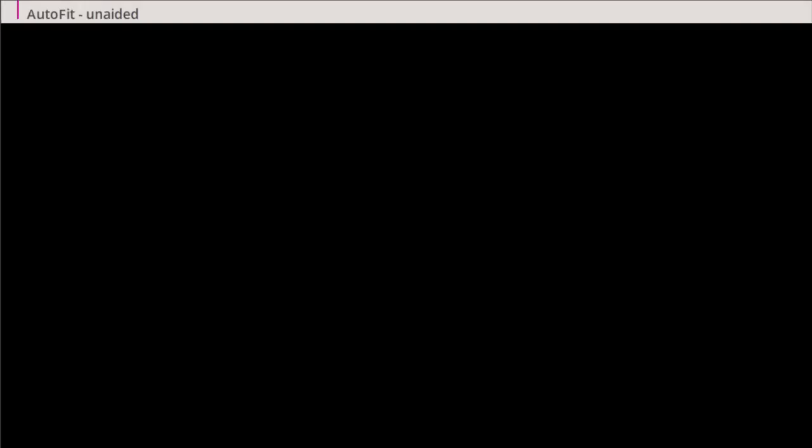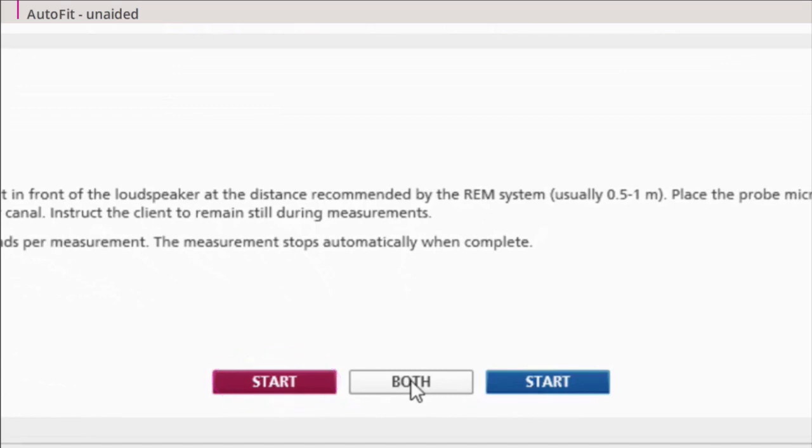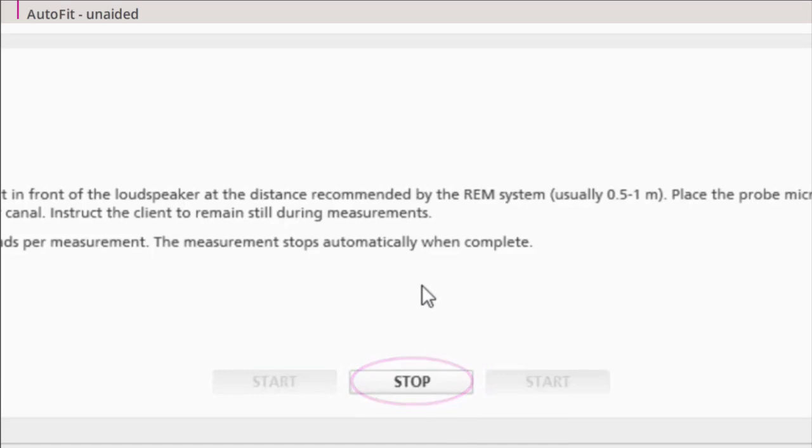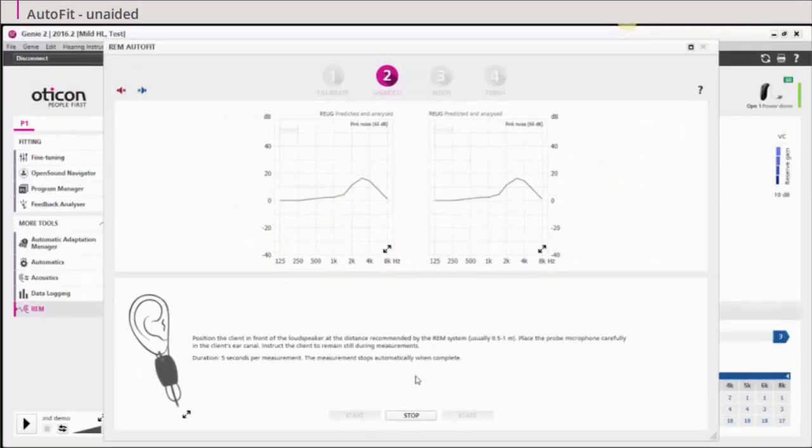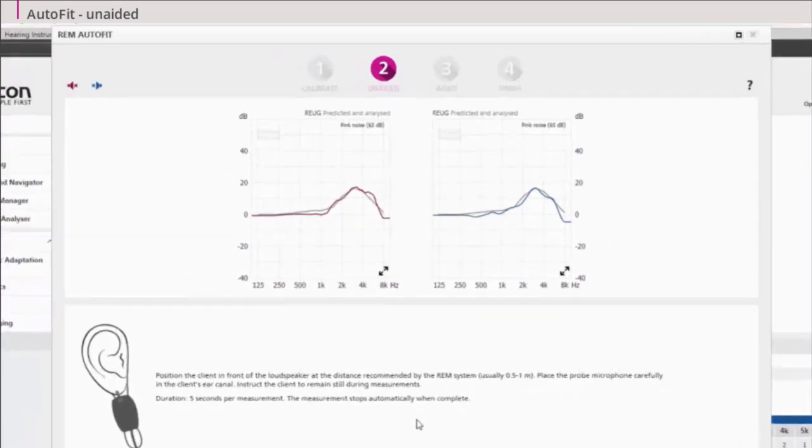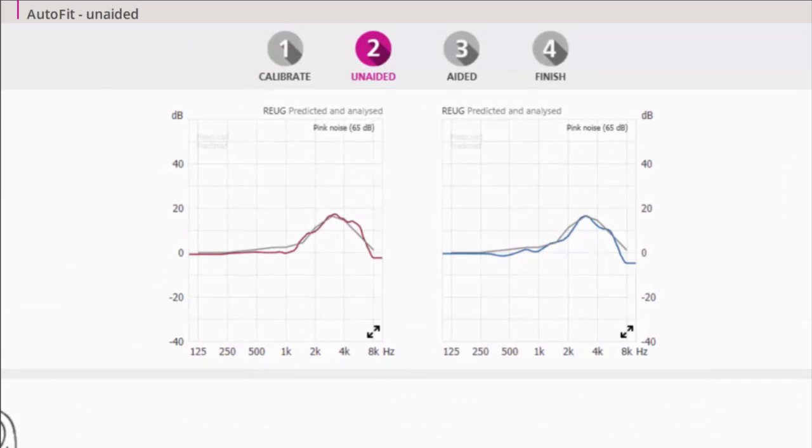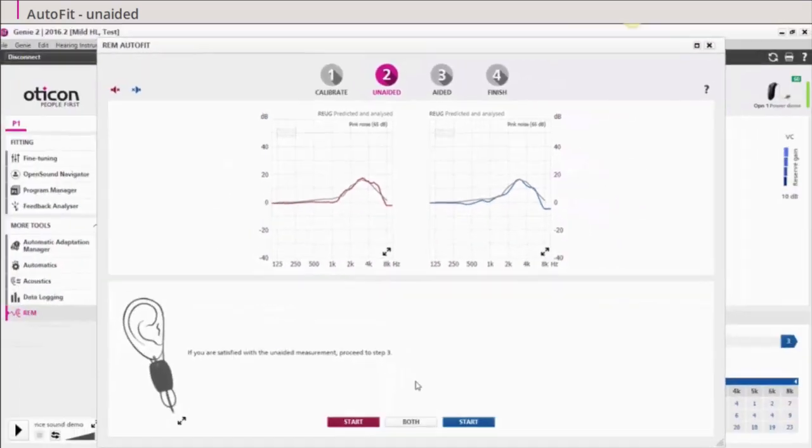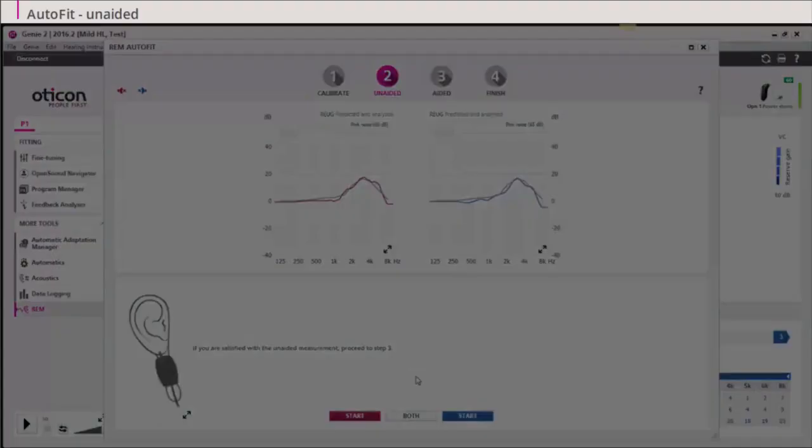Click Start to measure the real ear unaided gain or REUG for short. You can measure the side you wish or click both to measure both sides. You can now see the measured REUG in the graph together with an average REUG. The curve shown is an average curve and not a target. Your measured curve may deviate to some extent from the average. Make sure your measurement is above minus 5 dB at 6 kilohertz.